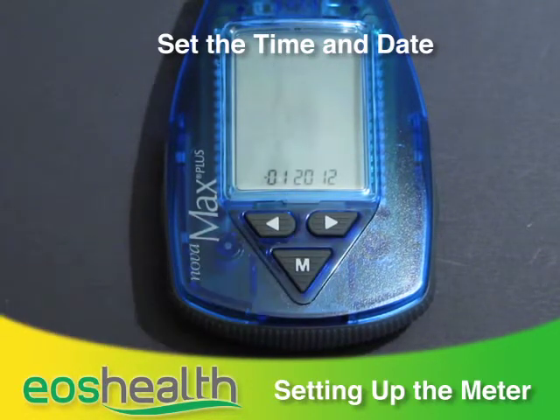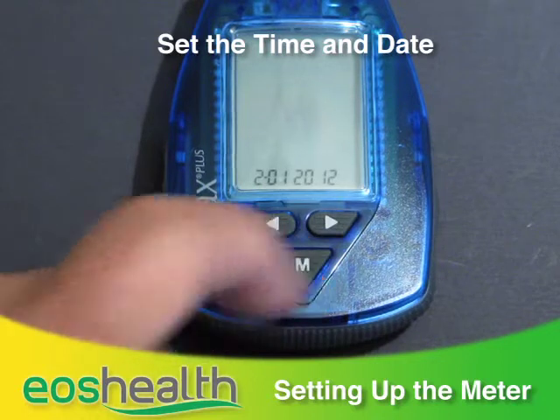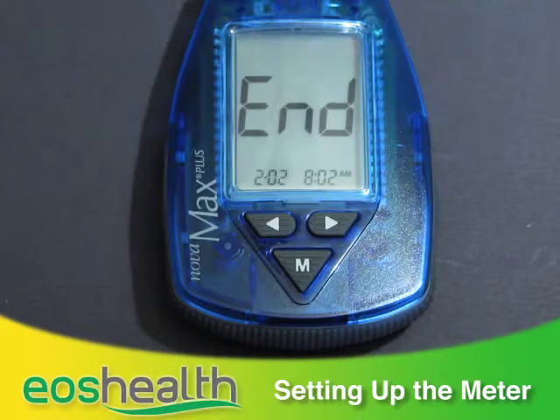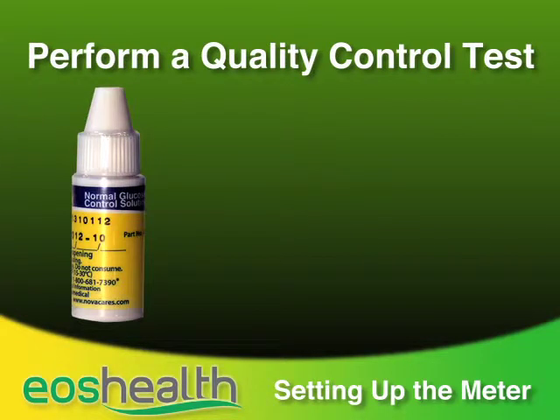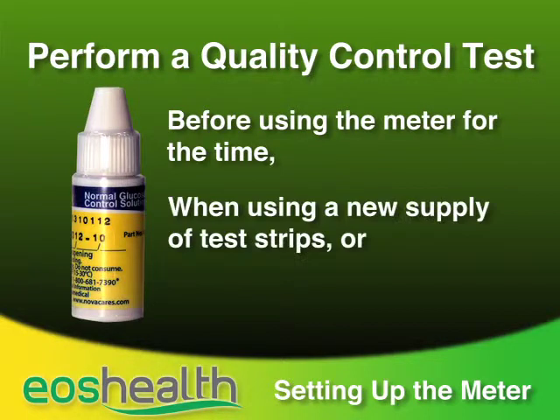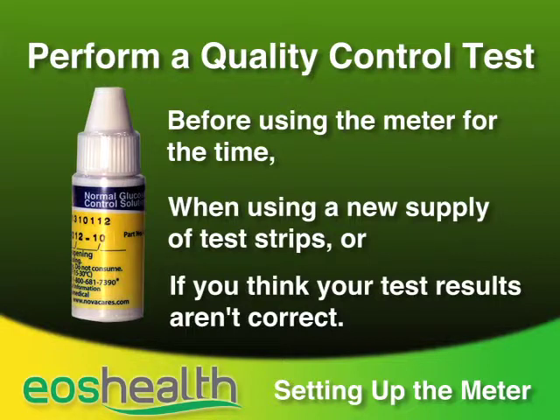Continue setting the year, month, and day. It's important to enter the correct time so we know the time of day for your readings. To make sure your readings are accurate, you should perform a quality control test before using the meter for the first time, when using a new supply of test strips, or if you think your test results aren't correct.